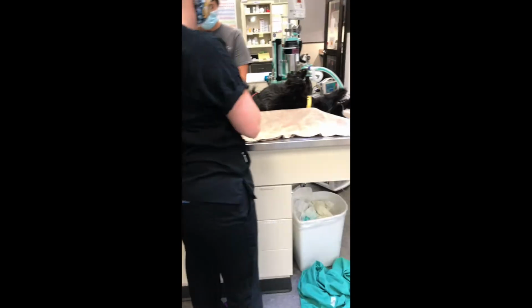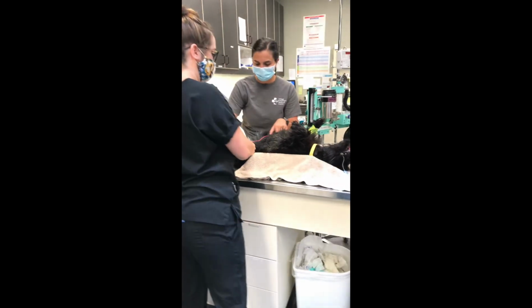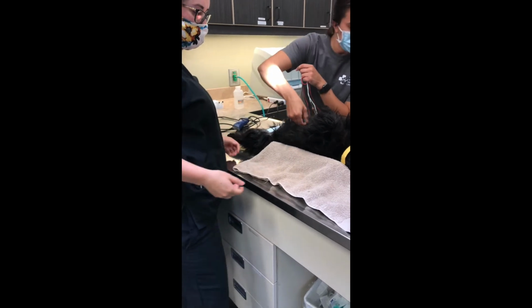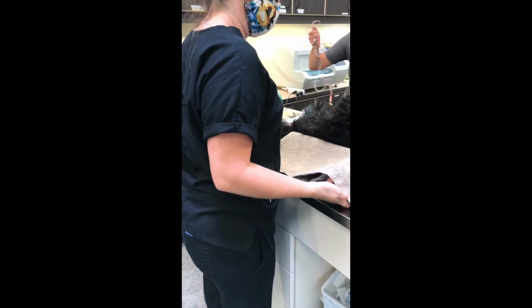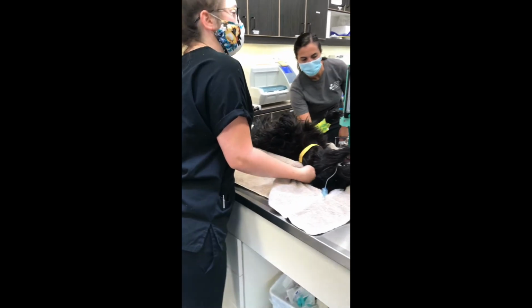So I can take the trough if you want to take the patient. So completely disconnect? Yes. You wanted to have the towel? No towel.